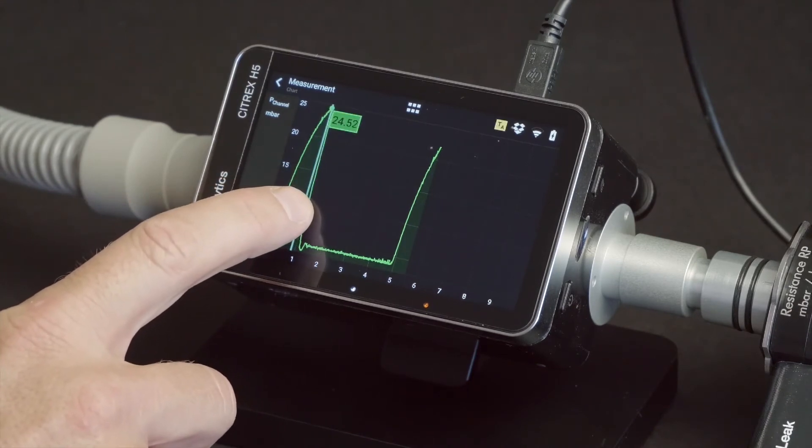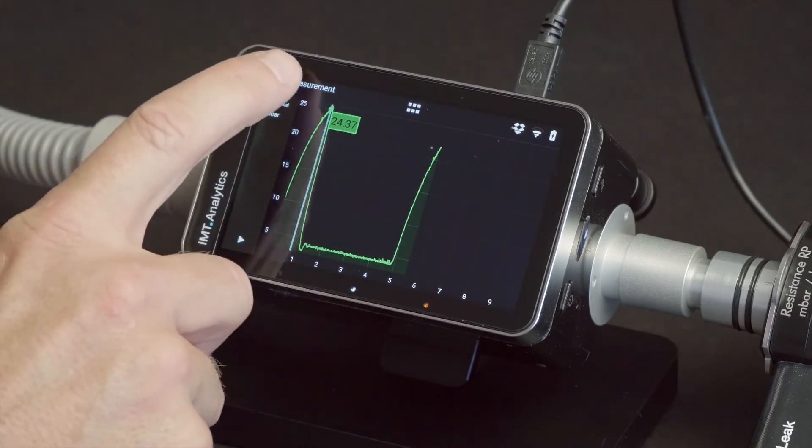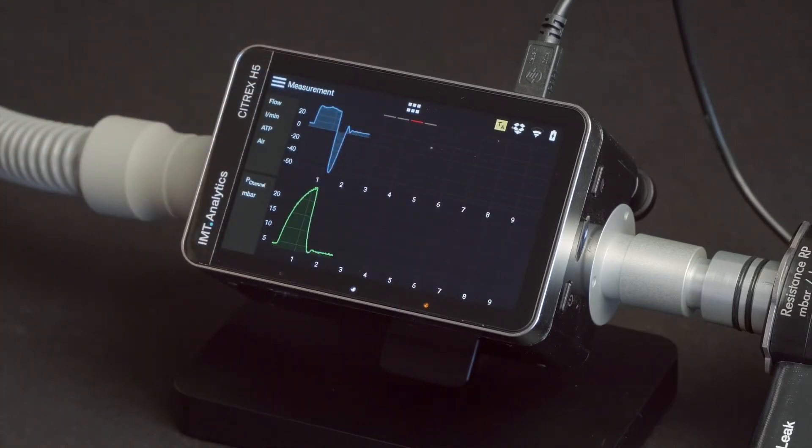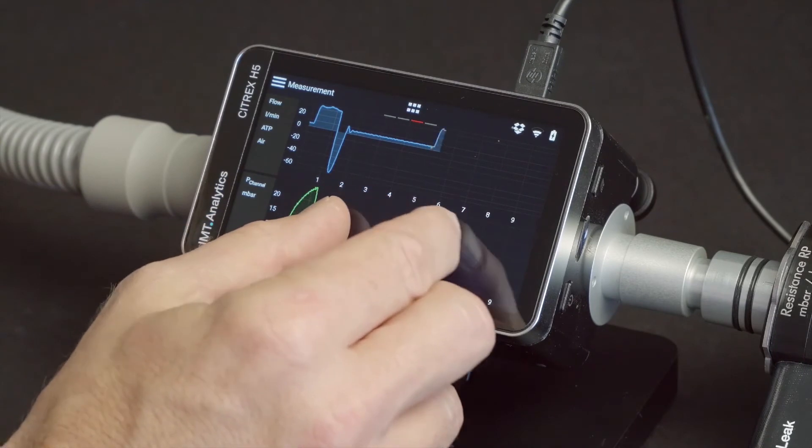With the pause button, you can also freeze the curve and perform measurements on it. Also, in this mode, you can zoom in or out on measurement curves.